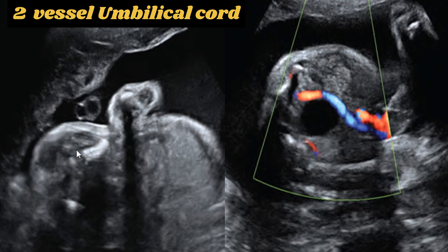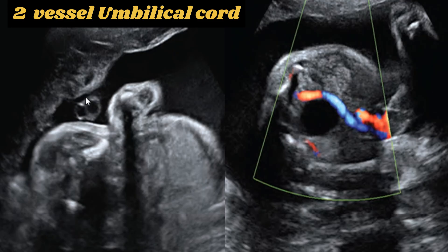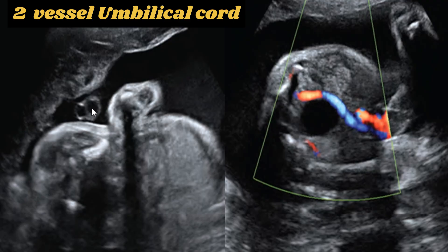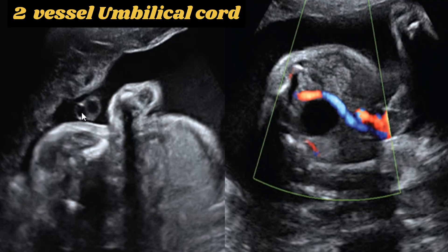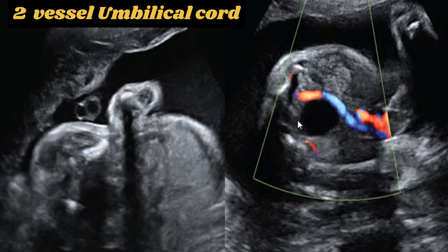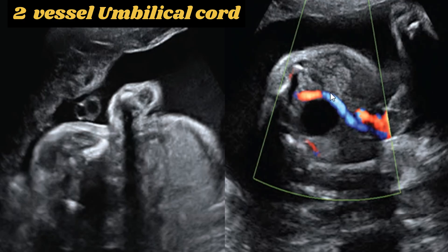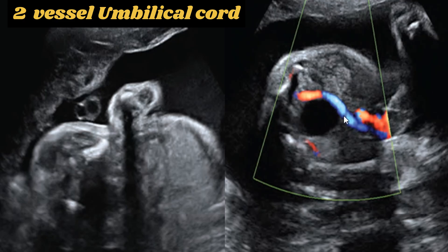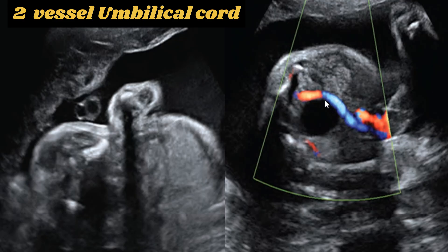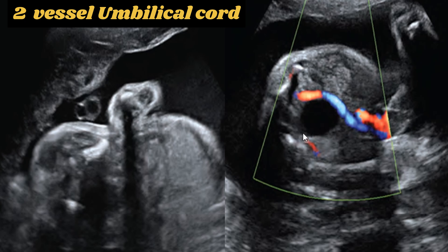This is an interesting case showing a two-vessel cord. This axial image of the umbilical cord shows one artery with a narrow lumen and one vein with a greater diameter, consistent with a single umbilical artery. The color Doppler image of the fetal pelvis at the level of the urinary bladder shows the umbilical artery along the lateral surface of only one side of the fetal bladder, with no umbilical artery on the contralateral surface — consistent with a single umbilical artery.